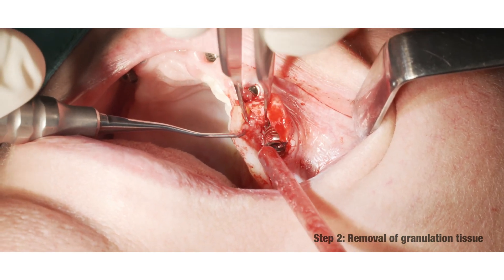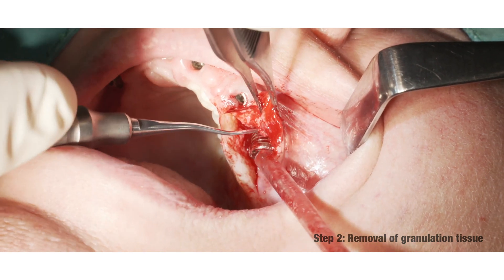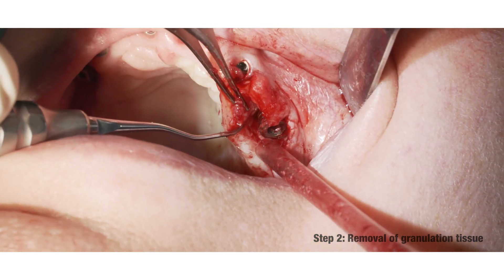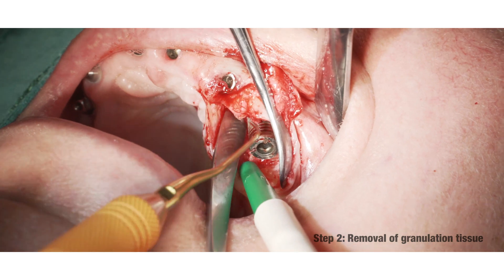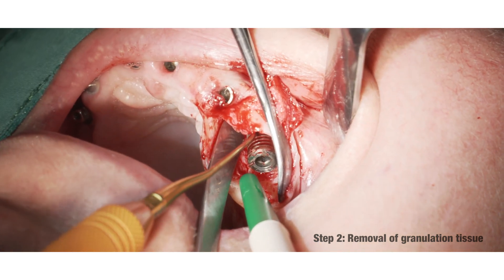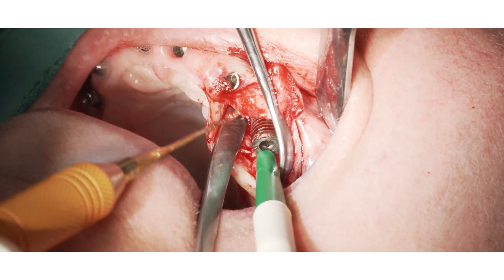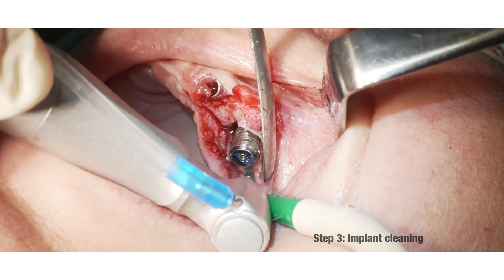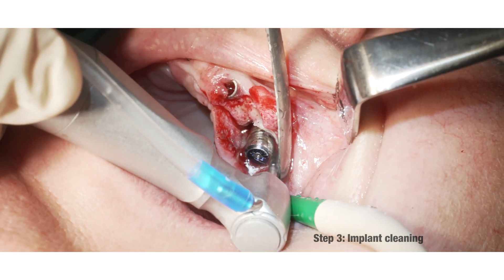The next important step is the careful removal of granulation tissue. Flattening of the coronal threads in an area where bony regeneration can't be expected. This partial implantoplasty provides long-term stability.